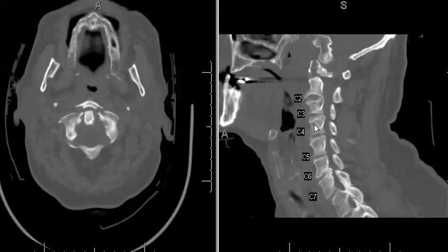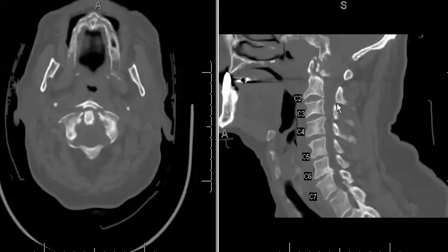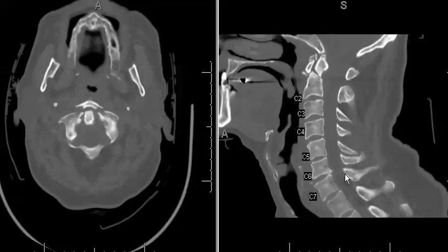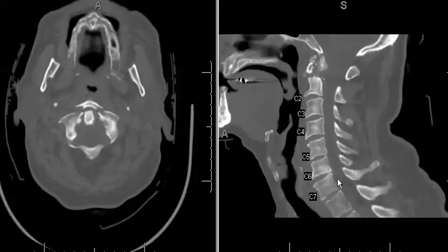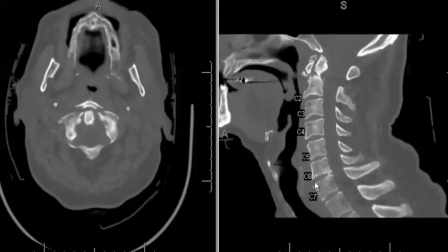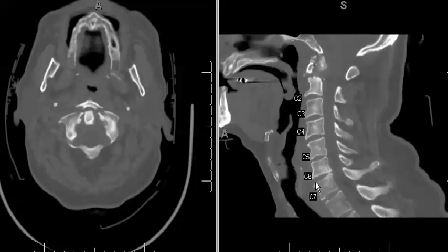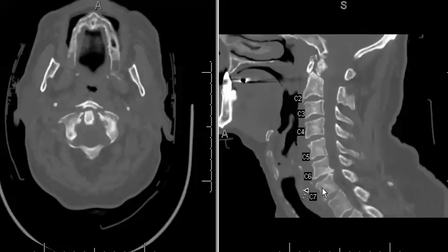C1 Jefferson Burst Fractures can have a high association with other cervical spine fractures, as in this case where there were fractures at C2, C4, and C7. Another pertinent finding is widening of the anterior intervertebral disc space at C6 and C7, which represents a hyperextension type injury.